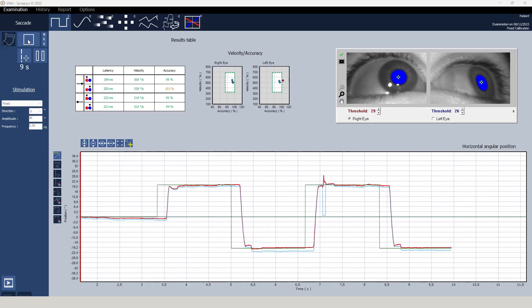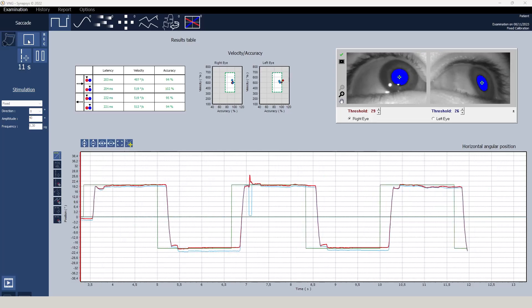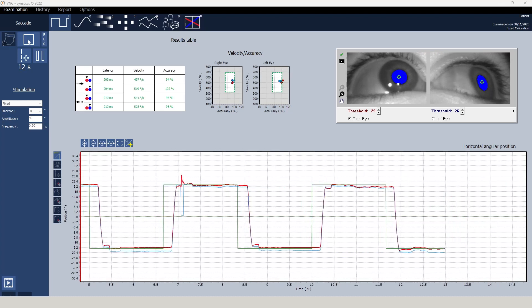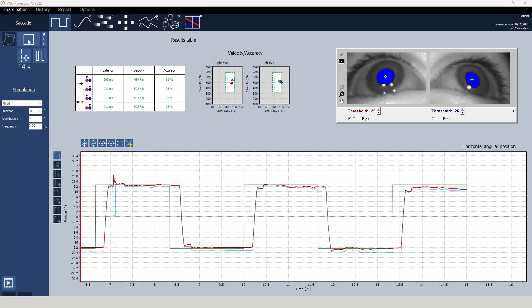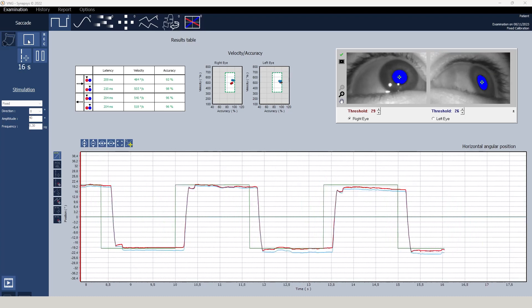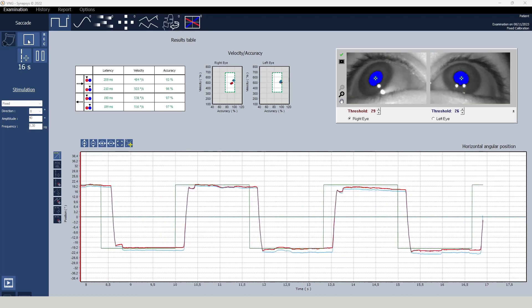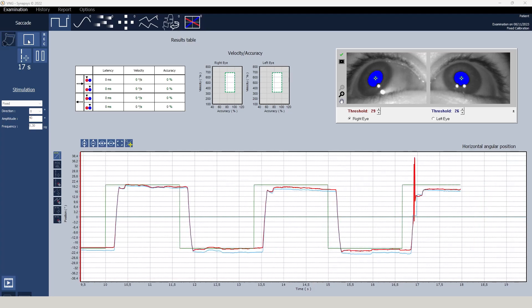Each examination presents a detailed velocity amplitude or velocity accuracy graph. In the lower section a comprehensive angular position graph displays eye movements relative to target motion. The option to display vertical or horizontal movements can be selected at any time.